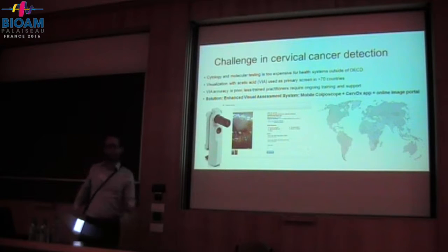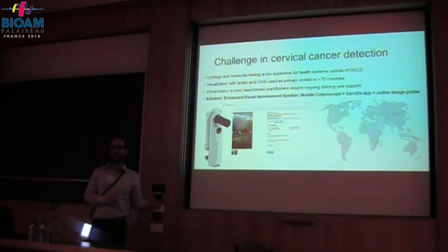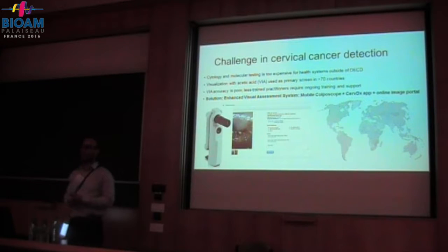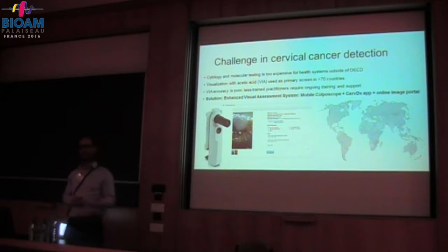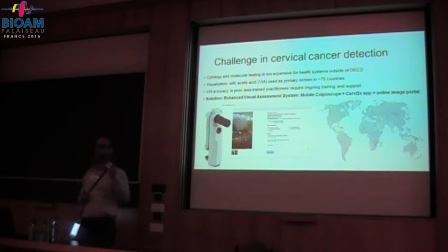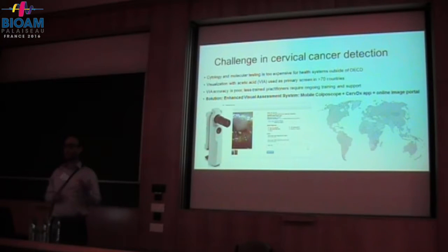Essentially, cervical cancer is a real big problem in most of the developing world where there's no access to screening like HPV DNA testing or Pap results. Often, most of the testing is done through visualization with the naked eye. The patient comes in, lays on the table, they insert a speculum into the vagina, they put a thin layer of vinegar on the cervix, and they look to see if any area turned white.